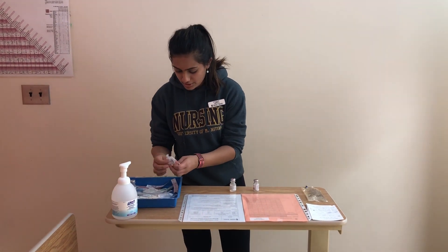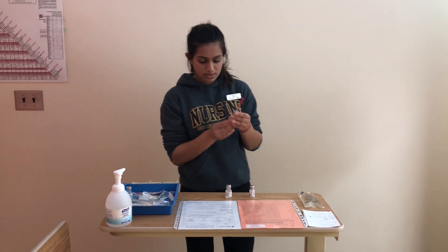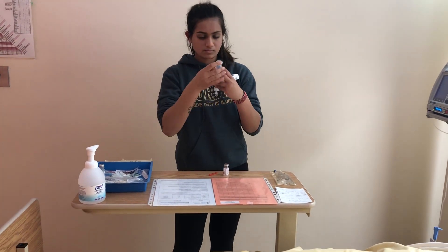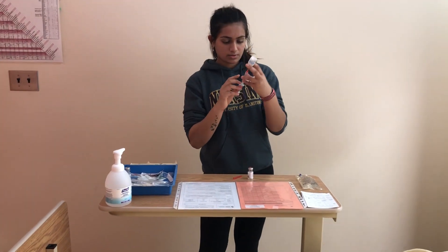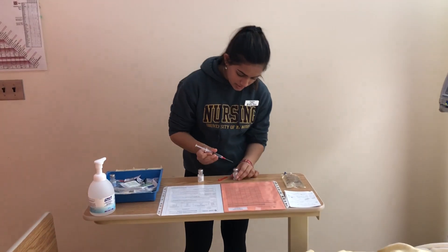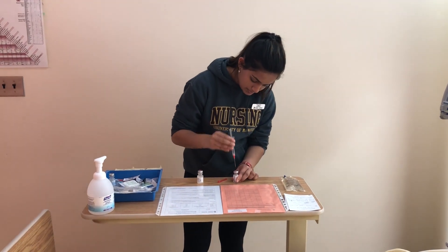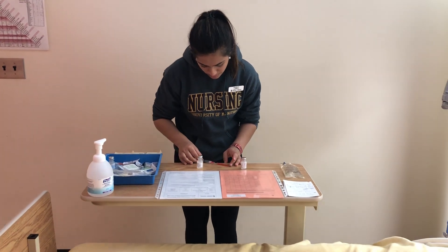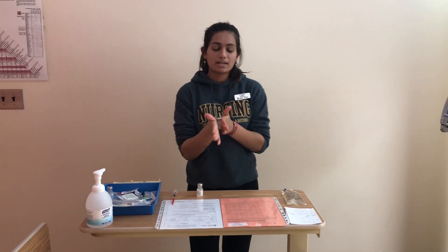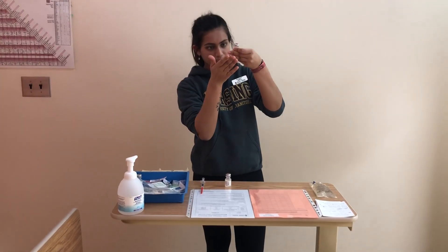I'm going to use a 3 mL syringe because I need 2 mL of sterile water. I now have 2 mL drawn up. Since I've already cleaned the vial, I'm going to use a scoop method to recap the syringe. Now I'm going to roll the vial between my hands, making sure not to introduce any air bubbles, and checking for any sediment — there is none.